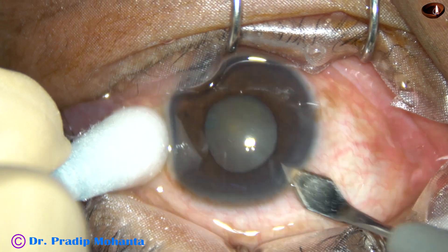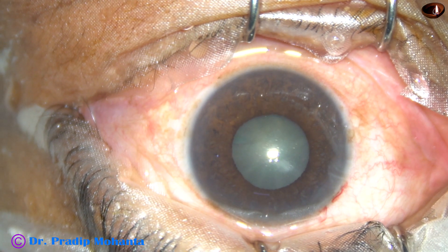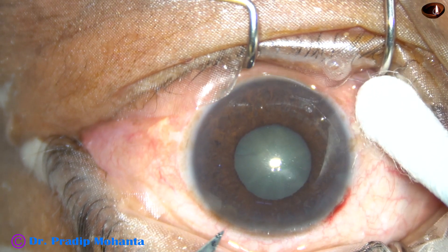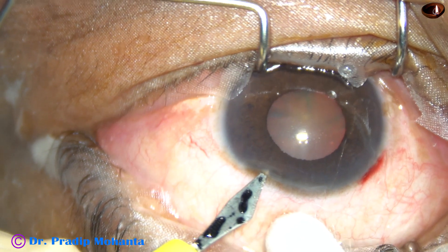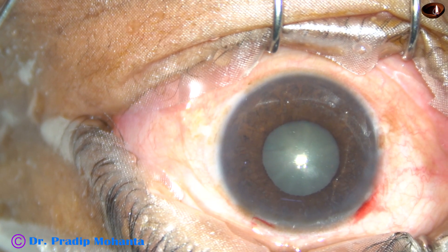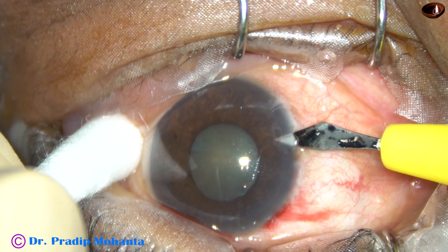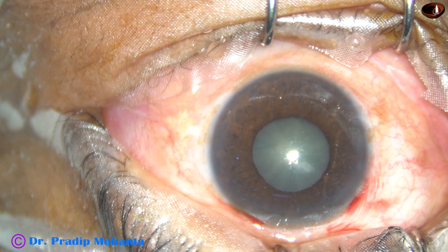This is the main incision at the selected site. And now this is a paracentesis on the left side of the main incision, about two and a half clock hours away. And this is another paracentesis on the right side of the main incision.